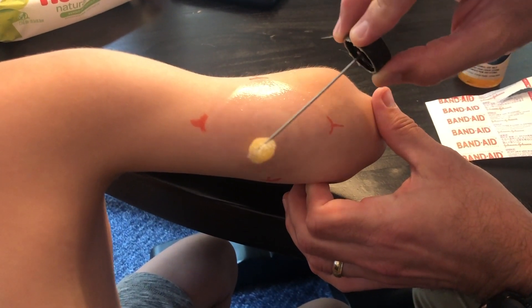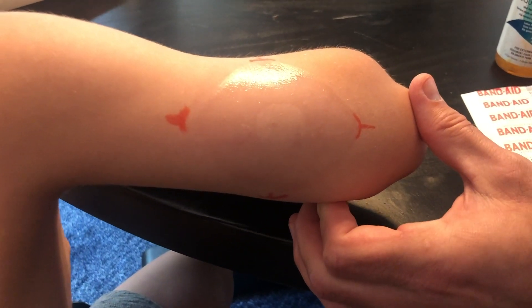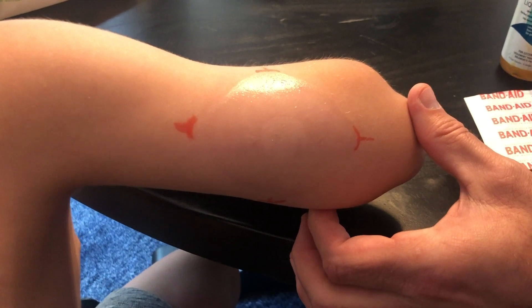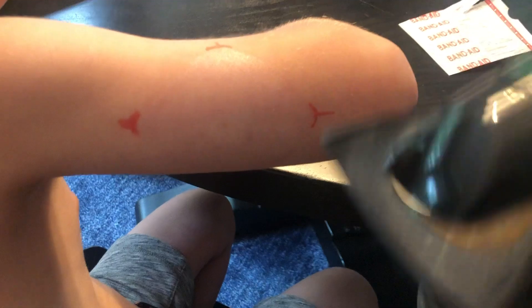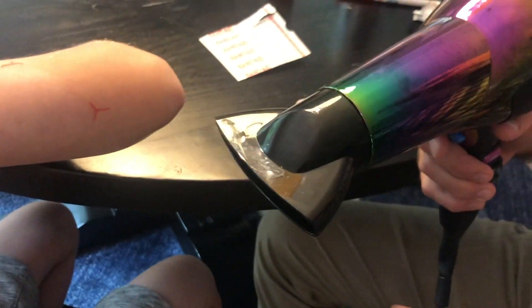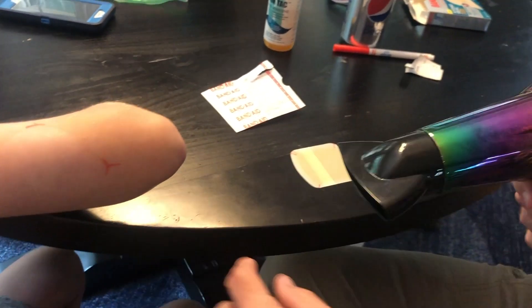I work my way into a circle, but I leave the middle empty so there's no adhesive that ends up on the lead as it goes into the skin. Next, I'm going to use a hairdryer to dry off the SkinTac so it's nice and dry and tacky.